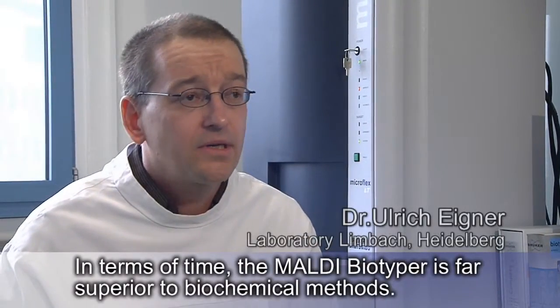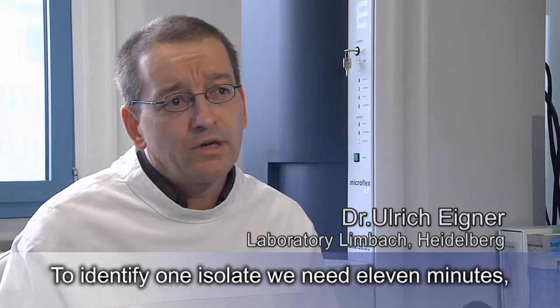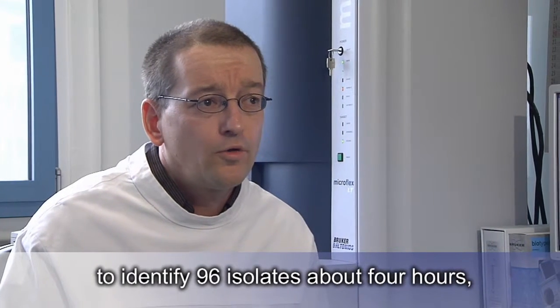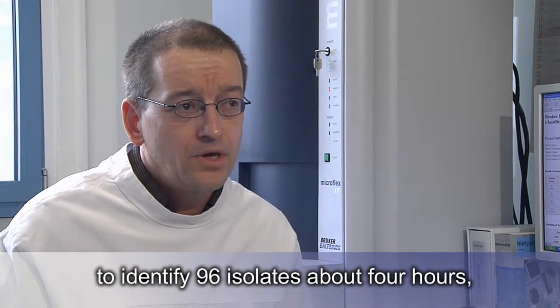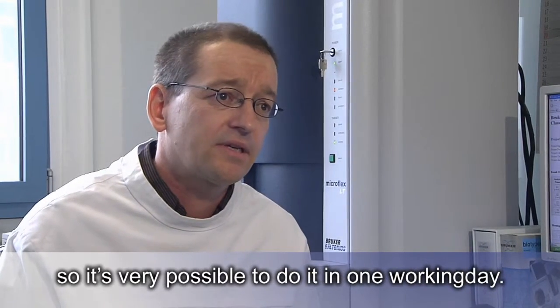In terms of time, the Maldi Biotyper is far superior to biochemical methods. To identify one isolate, we need 11 minutes. To identify 96 isolates, about 4 hours. So it's very possible to do it in one working day.